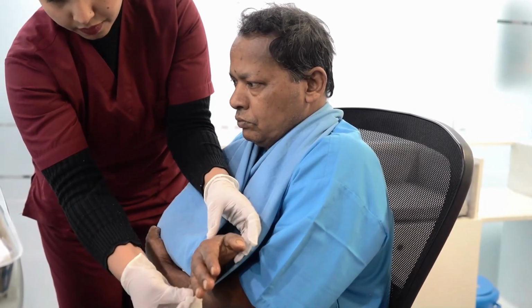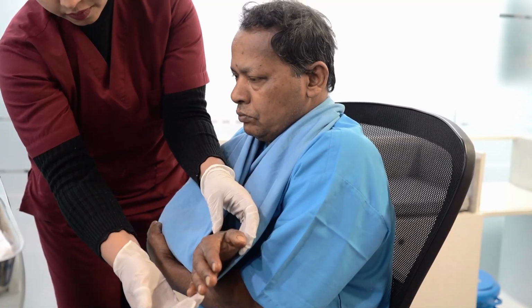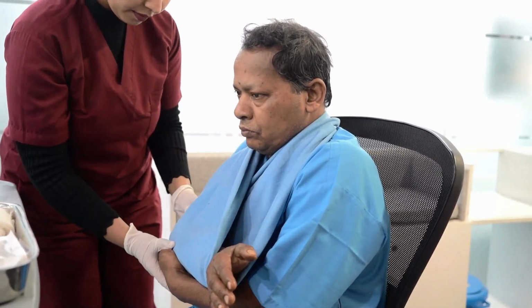Check the circulation in their fingertips every 10 minutes. Press their nails for 5 seconds until they turn pale, then release to see if the color returns within 2 seconds.